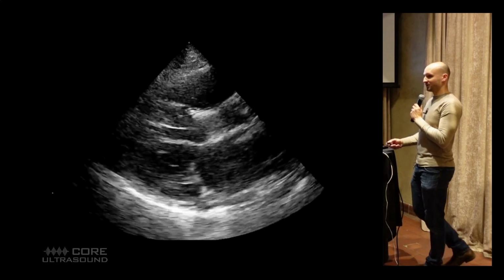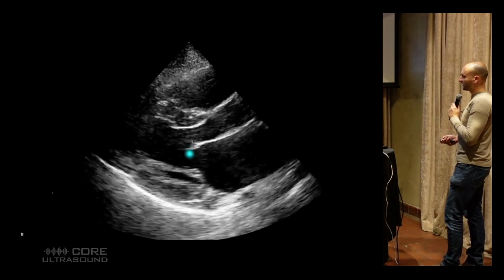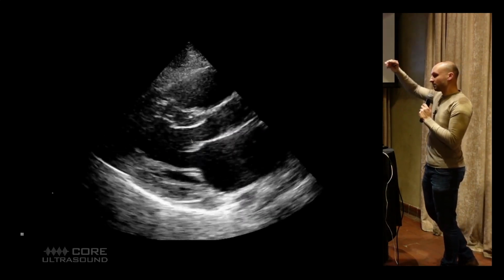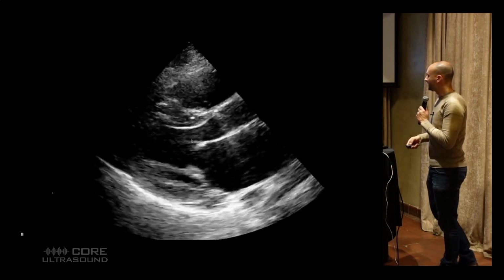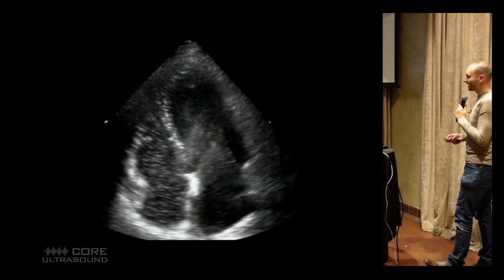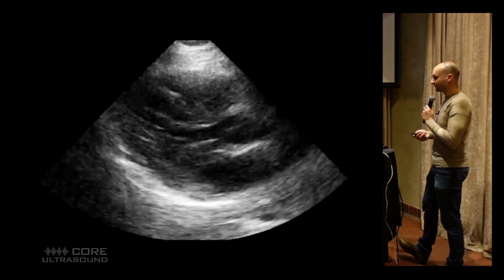It's shivering. Someone said shivering. I love that. It's fibrillating. And what I usually do is I look at the valves themselves. And you see how the valves are kind of just quivering? This is VFib. It doesn't matter what the monitor shows, this gets shocked. One of the other things that I think is helpful is to look at the bubbles in the heart. You see how the bubbles are kind of quivering as well? This is what fine VFib looks like.